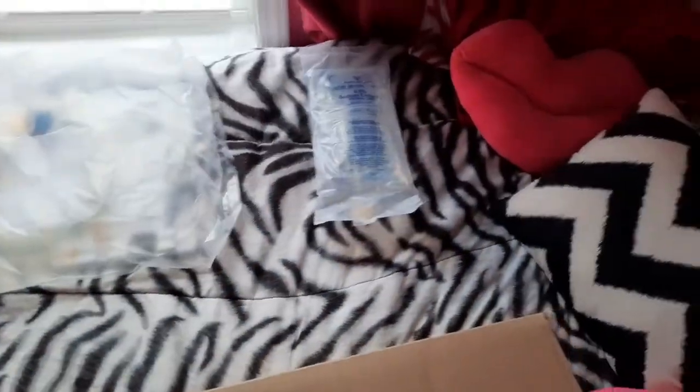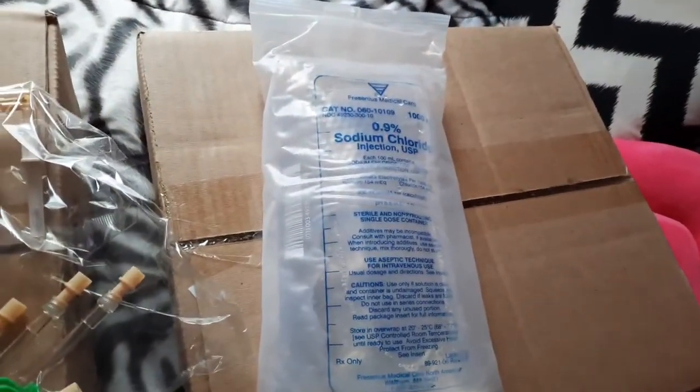And then we have the multi-line adapter, which will attach all the dialysate bags together. To the right is our saline bag, sodium chloride 0.9%. You check the date on the back, and this one says October 21st, so we're good there. Then we have our cartridge with dialyzer, which actually does the dialyzing. It's got all the lines, and we'll show you that as we get to it.